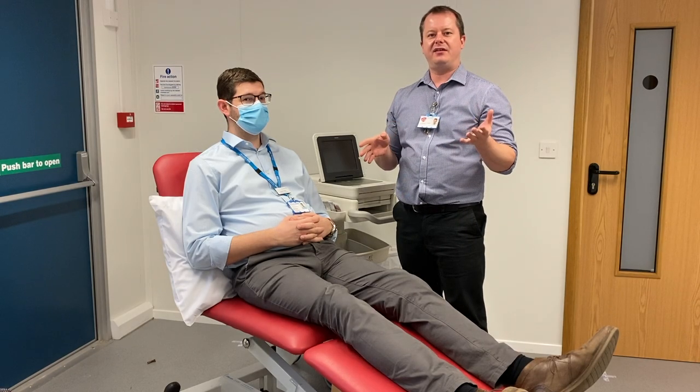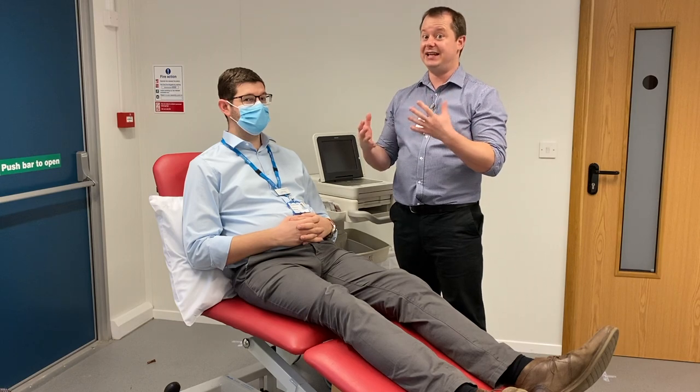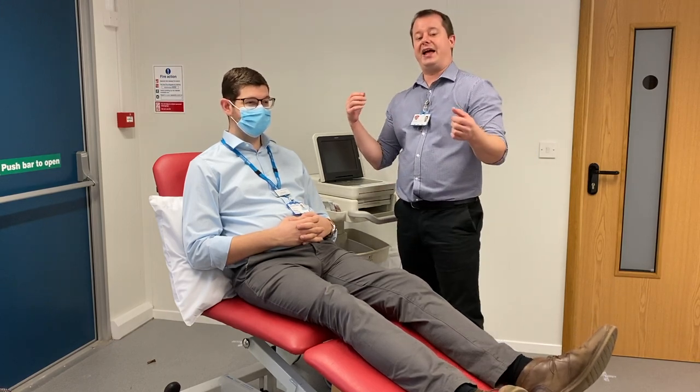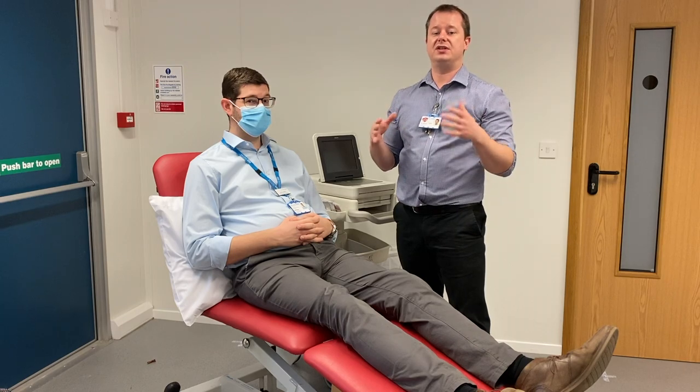Hello everyone. We're going to run through doing 12-lead ECGs — sticking them onto the patient. I'm going to be using James, my wonderful assistant. Thank you very much, James. And then we're just going to run through the process of making sure that you do this properly.